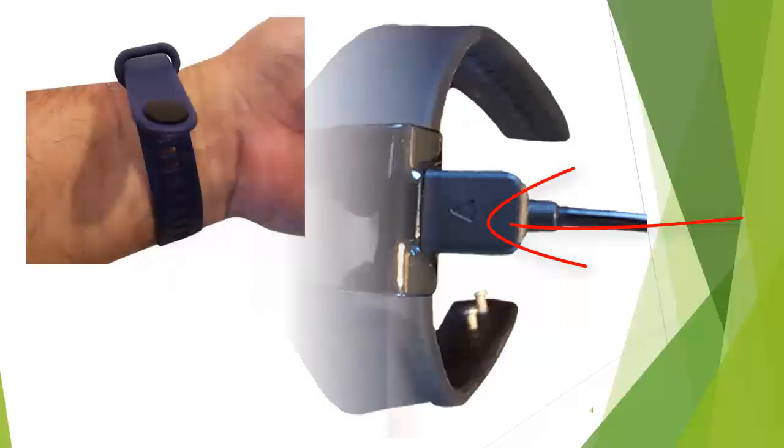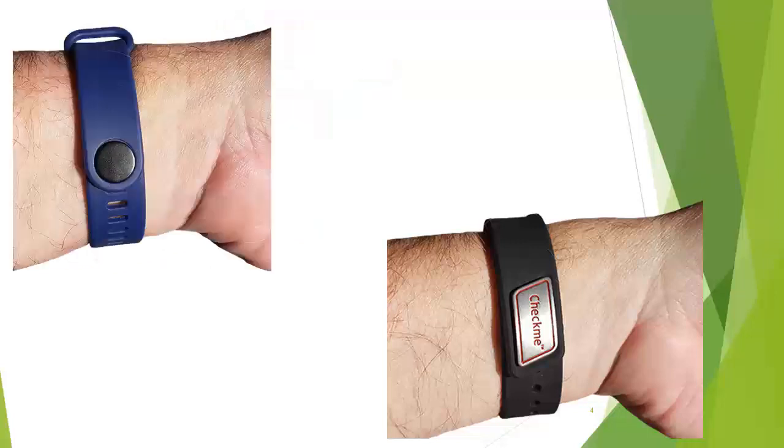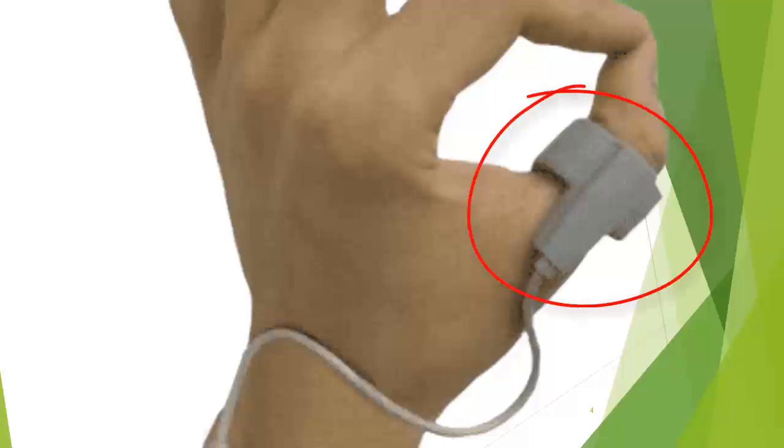When you are ready to start your study, place the wristwatch on your non-dominant wrist, keeping your dominant hand free. If the wristband is purple, thread the strap through the loop and push on the black snap into a comfortable location on the opposing strap. Do not have the strap too tight. If you have the black strap, line up the two prongs over the opposing strap and push the prongs into the strap so that the wristwatch is comfortable. Once the strap is on, place the thumb sensor over the thumb past the first knuckle.